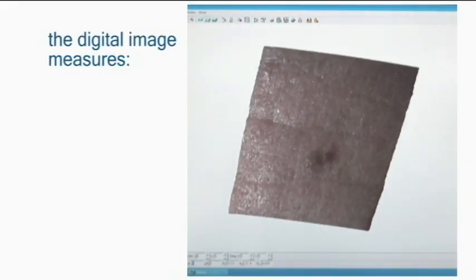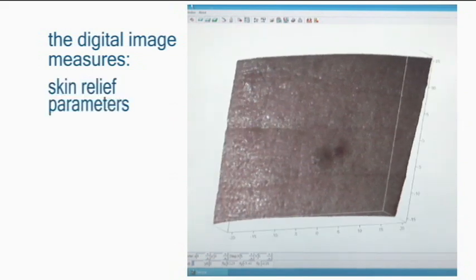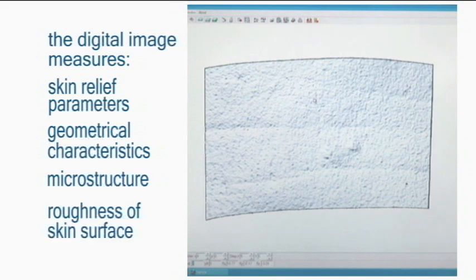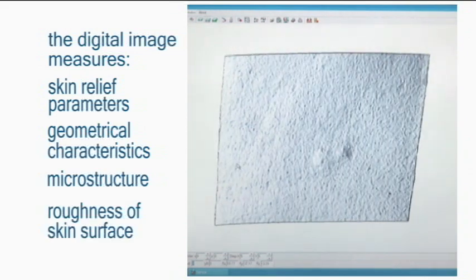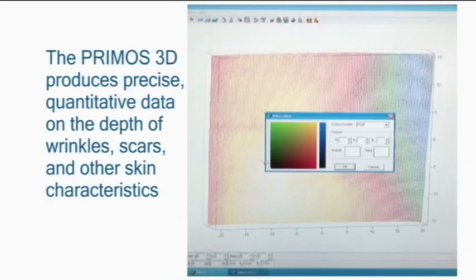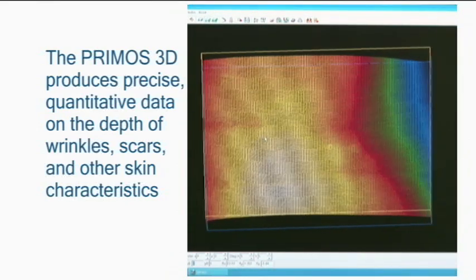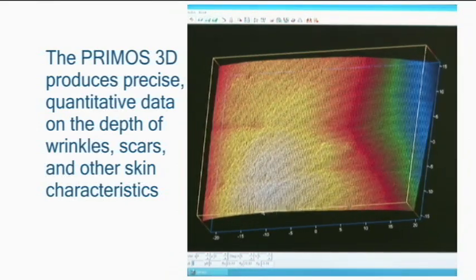The digital image produced can provide direct measurement of skin relief parameters, geometrical characteristics, microstructure, and roughness of the skin surface. Never before has it been possible to produce precise, quantitative data on the depth of wrinkles, scars, and other skin and body characteristics.